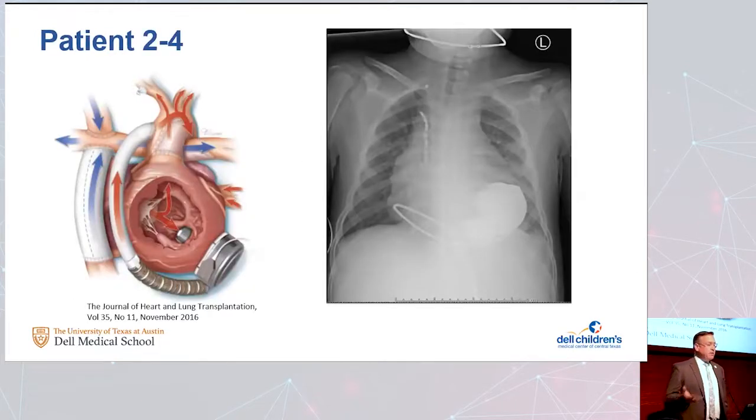So the rest of our patients, we did implant in a relatively normal pathway. We did put the pump in the systemic ventricle, but the systemic ventricle was a right ventricle, which is full of heavy trabeculation, a perfect nidus for pump occlusion and also for a thrombus within that ventricle. Low heart failure patient, low cardiac output patient, a lot of trabeculae. We had to be very careful to make sure we didn't have any thrombus within there.